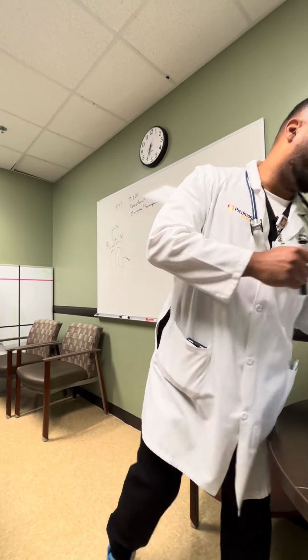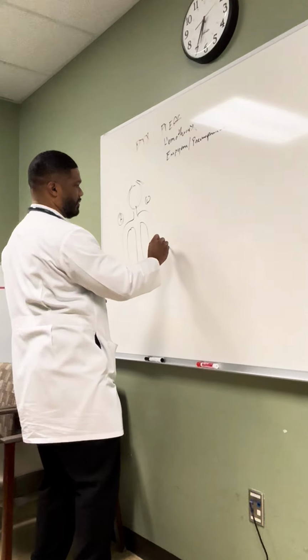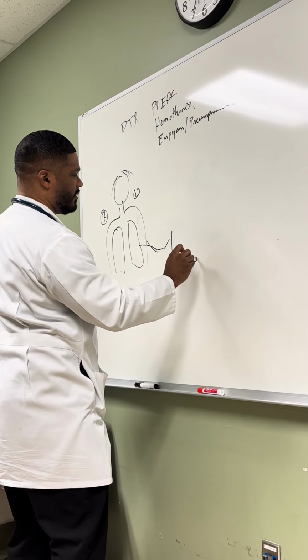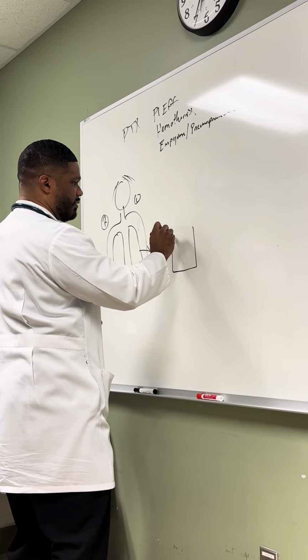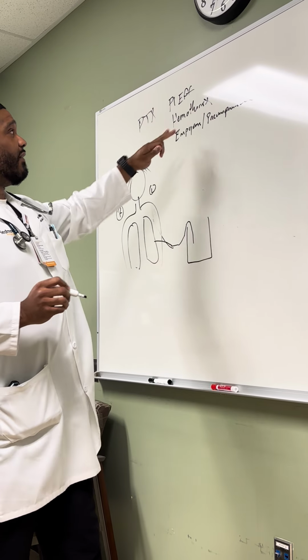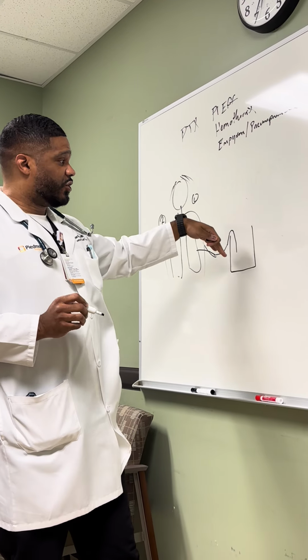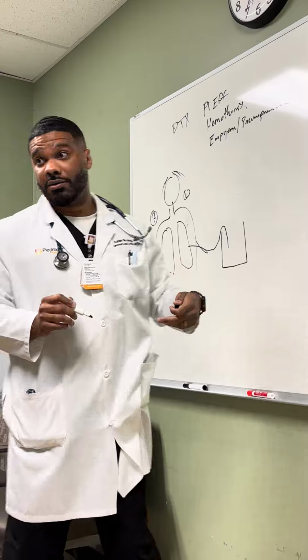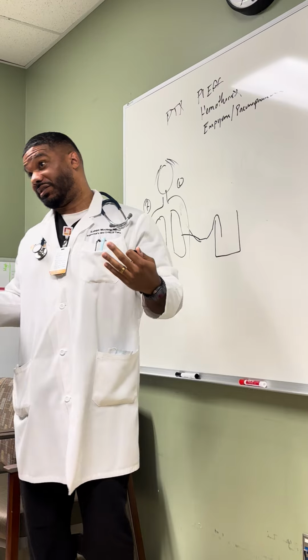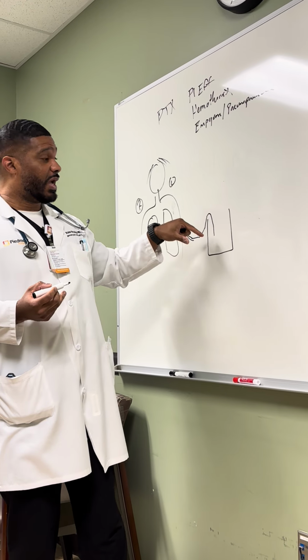So when we place the chest tube, well, let's back up. Back in the day, we, as in the medical community, used to place the chest tube and drain whatever was going on in the patient's pleural space into a jar or a bucket or whatever at bedside, right? As you can imagine, there were some complications with this.